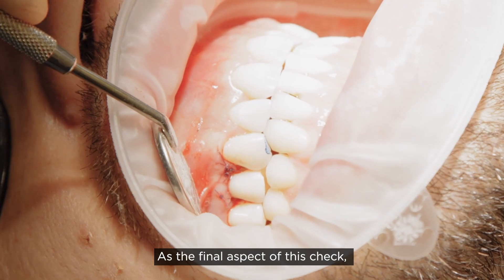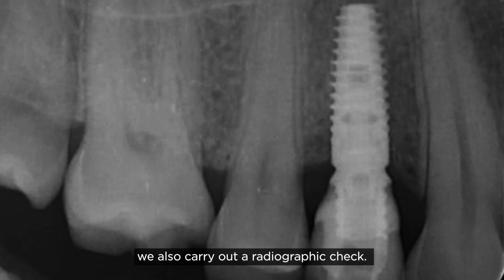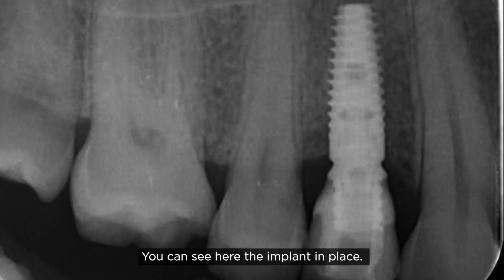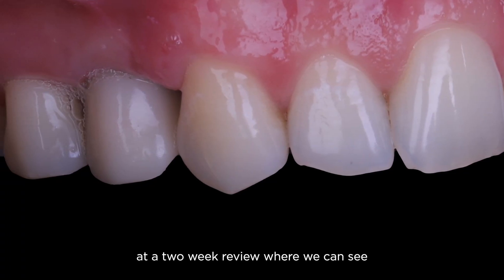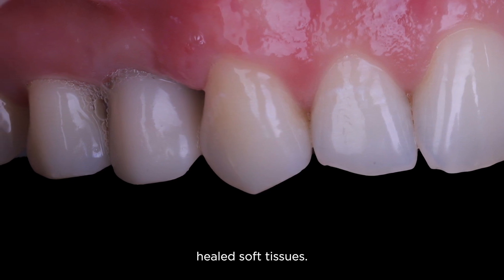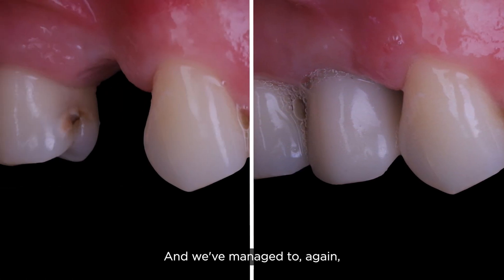As the final aspect of this check, we carry out a radiographic check — you can see the implant in place in a good position. This is the patient at a two-week review where we can see really nice, healthy, healed soft tissues, and we've managed to make some efforts towards dealing with the dehiscence.